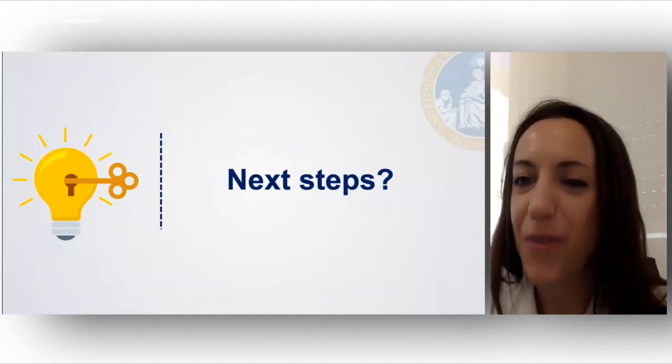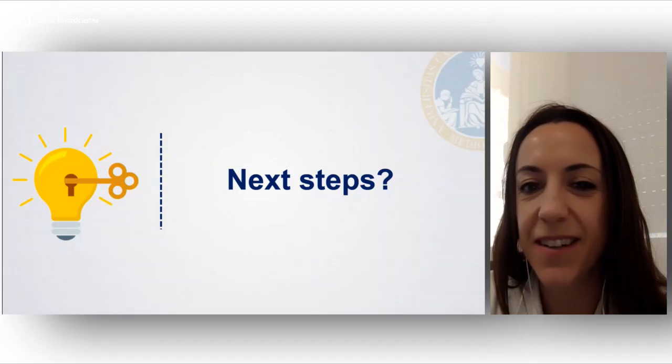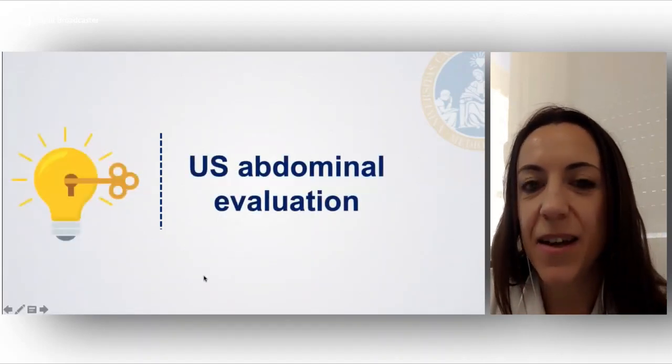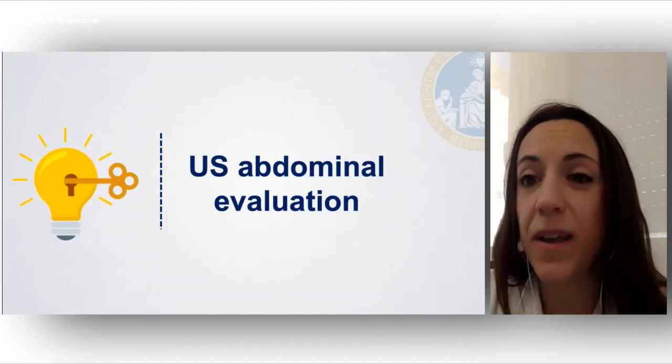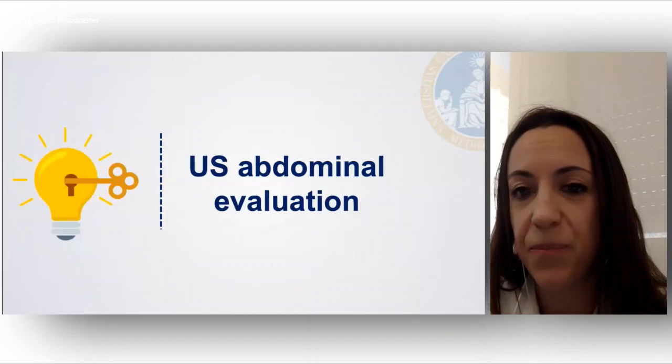Yeah. Before that, I agree with you. But my next step was to assess the patient with the transabdominal ultrasound examination to assess the spread of disease.